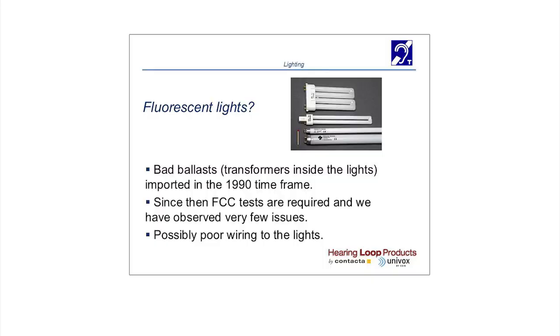Fluorescent ballasts: in about the 1990s, a number of the companies in the United States ordered millions of ballasts from a country on the other side of the seas, and they all came in bad. They all had huge amounts of ground issues. And the only really good part about that is none of them lasted very long. Somewhere around the year 2002, almost all of them burned out. I still do run into a few, but I have actually been into a church that just reballasted back in about 2000, the whole facility, and it was just a nightmare from one end to the other.